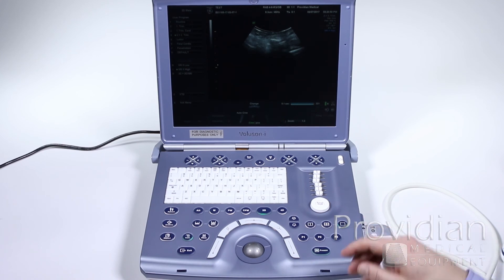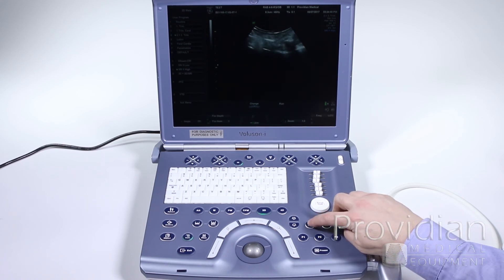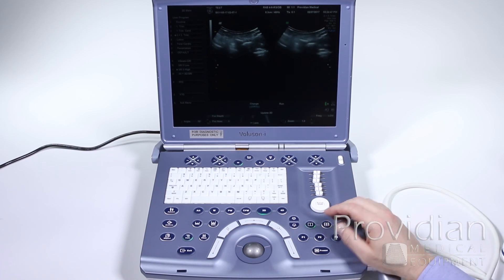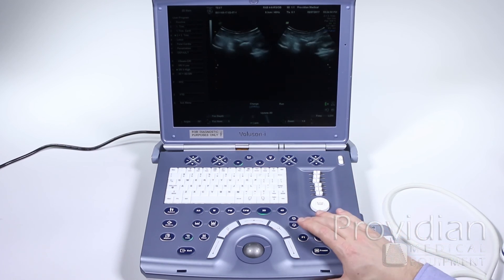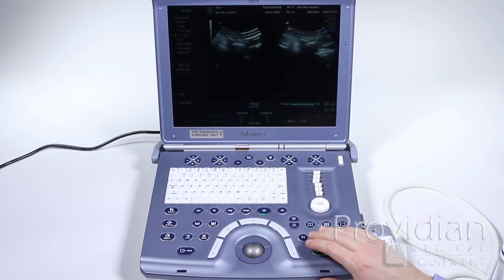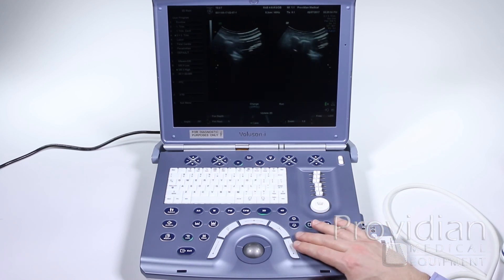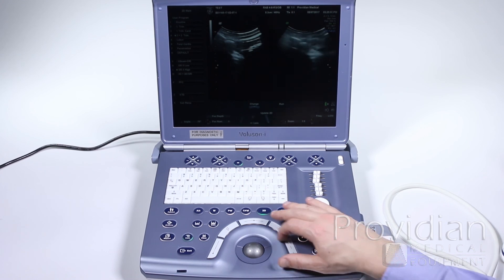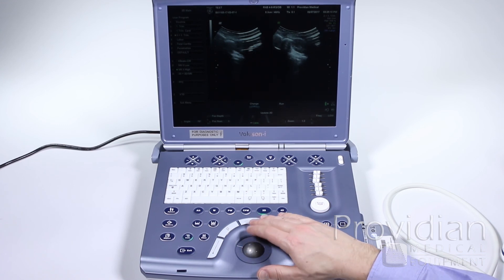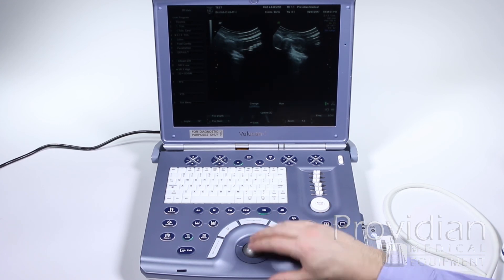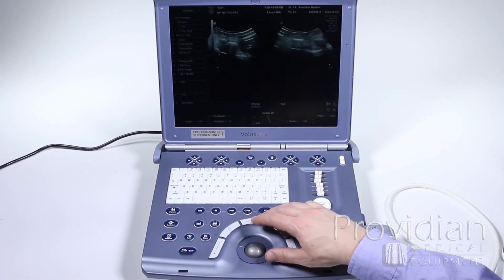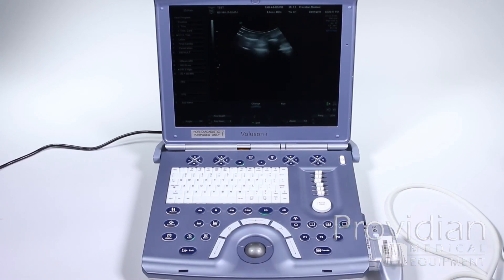Let's get into the dual screen and quad screen real quick. I'm going to unfreeze the image. To go to dual screen, I'm just going to press that button the first time. The second time will give me the second dual screen image, and I can continue to go back and forth. If I want to freeze it, I have this update 2D where I can update it and go back and forth between those two images. By pressing the Change key I can change the position of this 2D. Pressing it again will let me change that position. To get out of that, I'm just going to hit the 2D button and it will take me back to the larger screen.